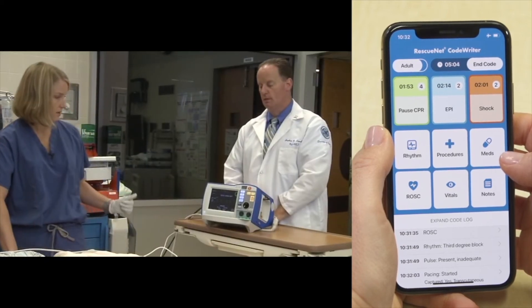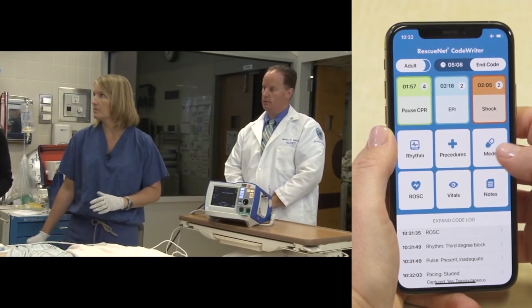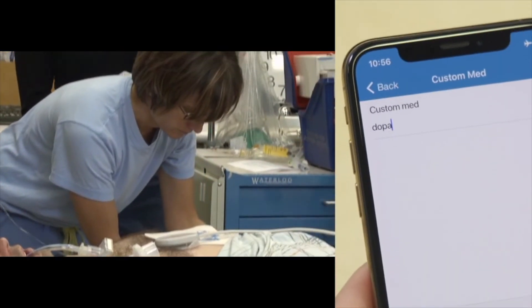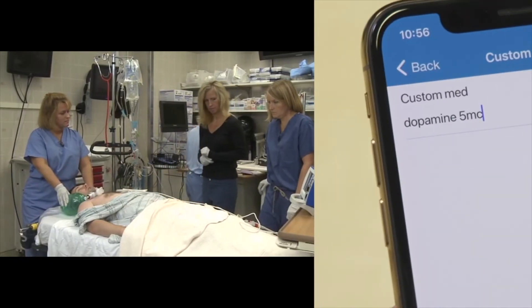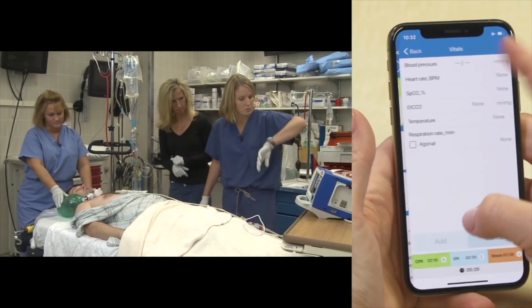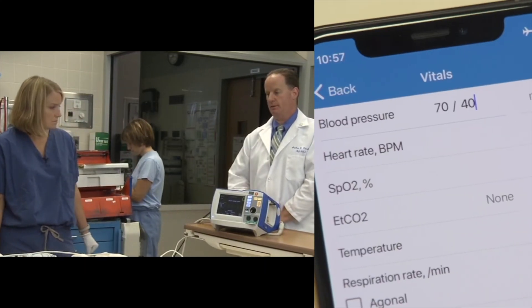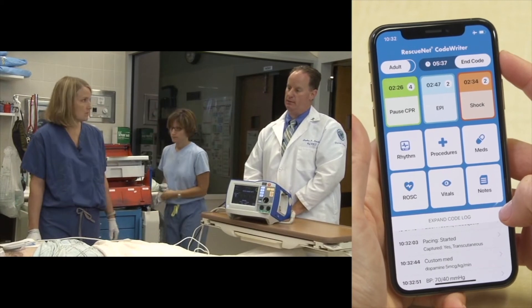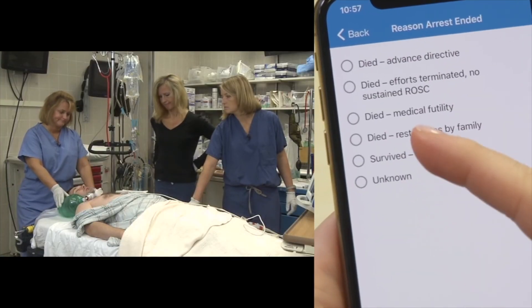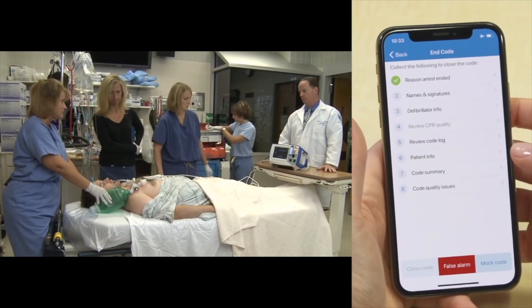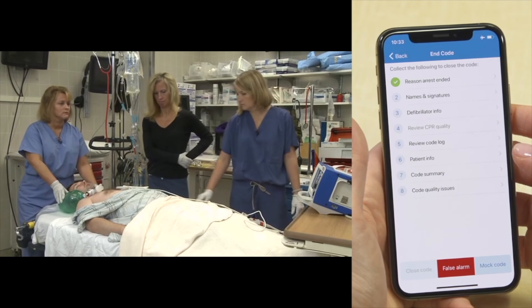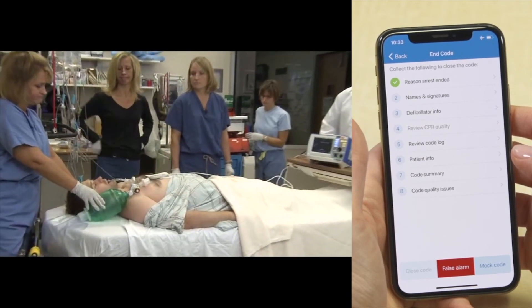Blood pressure without dopamine is 70 over 40. The team gives the dopamine time to work and monitors the patient. The team plans to transfer the patient to the coronary care unit. They note the presentation is consistent with something John's visitors may have given him. Orders include continuing to titrate dopamine for blood pressure, placing a Foley catheter, maintaining pacing, and obtaining a ventilator.